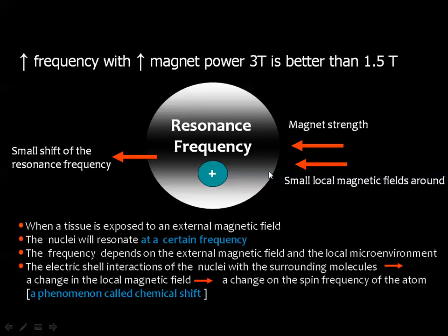This shift in the resonance frequency of different proton groups is known as the chemical shift phenomenon.